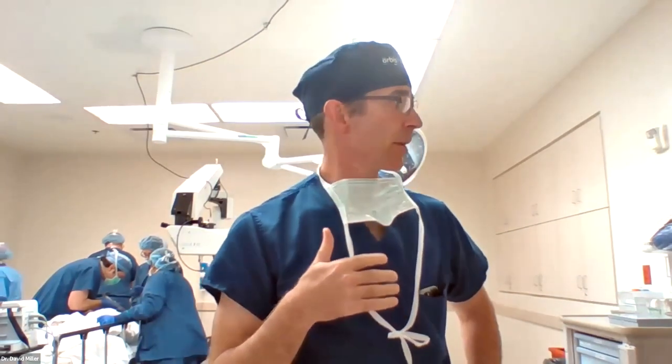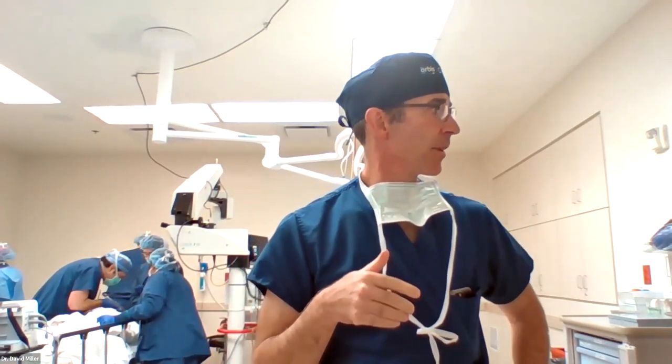Does this type of IOL, intraocular lens implant, have any side effect? The one everyone knows about is opacification with intraocular gas, which we covered earlier, which I think is so rare. In my own personal experience, I don't even recall what the percentages are, but it's so rare, I just don't see it as much of an issue.